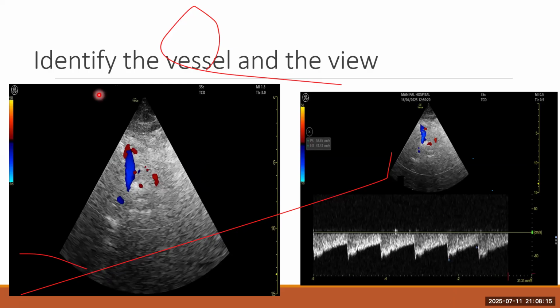Suboccipital view, sir. Yeah, suboccipital view. So I am insonating, basilar, right? Yeah, probably at the start of the basilar. So here, as we can see, a little bit higher PI than other anterior circulation vessels.